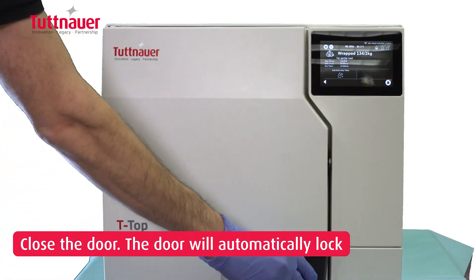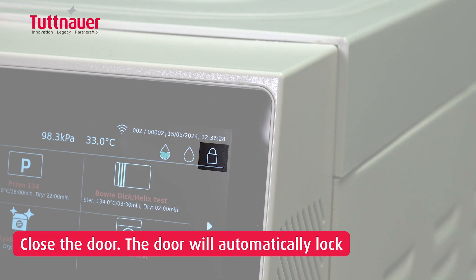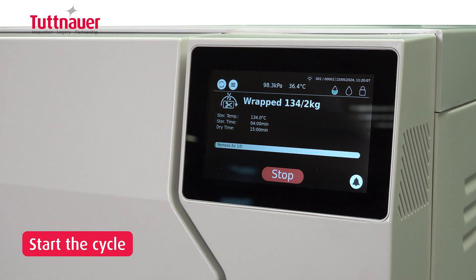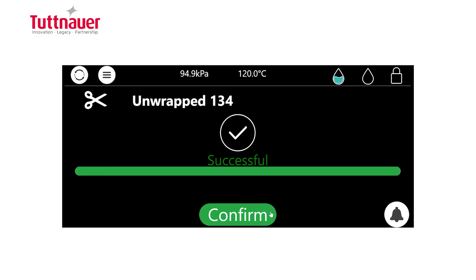Close the door and press the Start button. The bar will show the remaining time until the cycle is complete, and an audible alert will notify you when the cycle is finished.